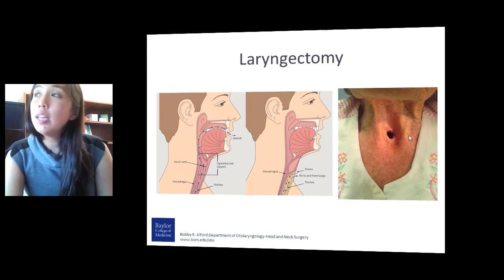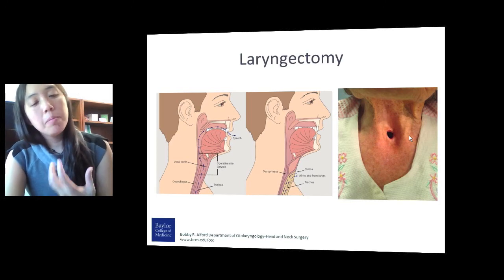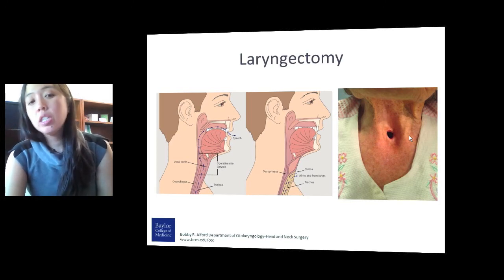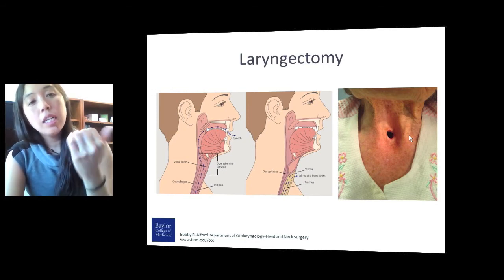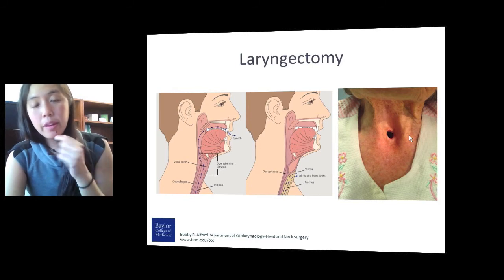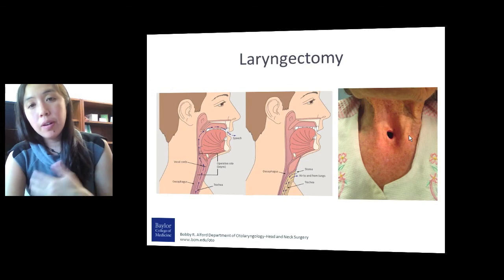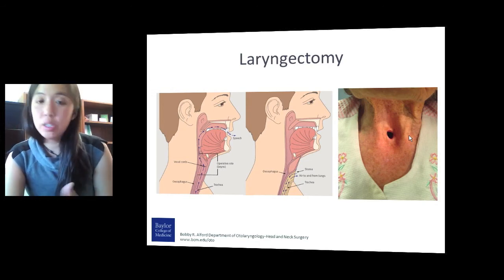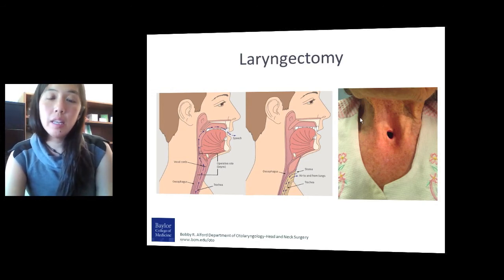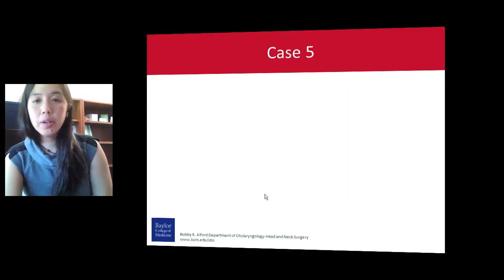Because again, with a tracheostomy, if the trach becomes dislodged and you can't replace it, or becomes obstructed, in a pinch, depending on the reason for which they were trached, you can sometimes intubate them from above, by mouth, if you can't get a trach back in their stoma. However, with a laryngectomy patient, you cannot do this, because if you put a tube in their mouth, it will only go into their esophagus.